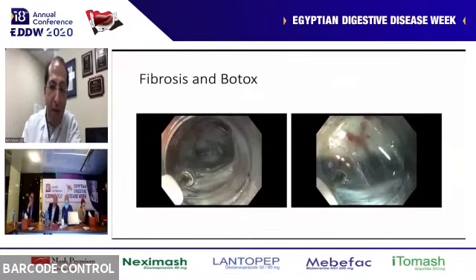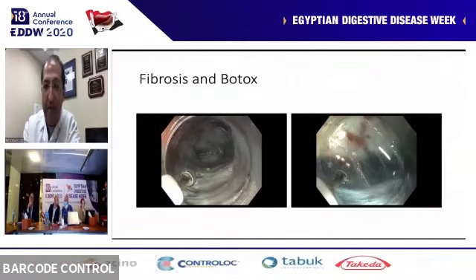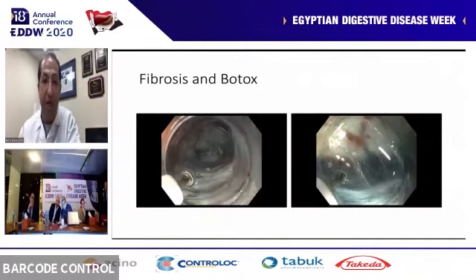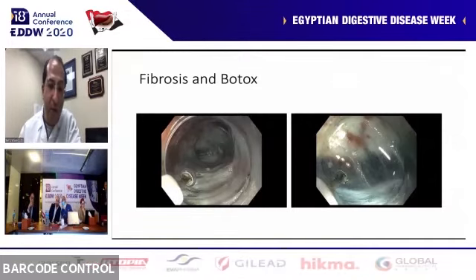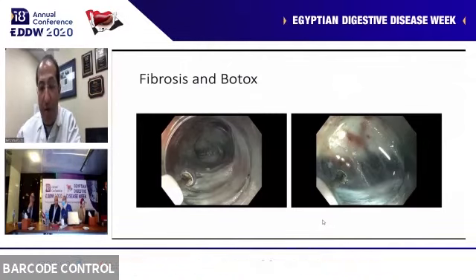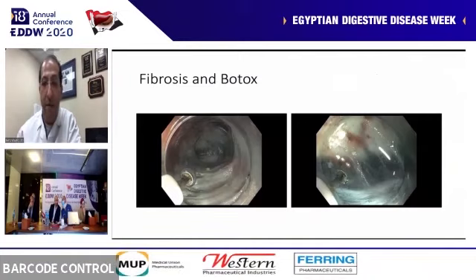Again, Botox gives a lot of fibrosis. In that case to the left, and also in a close look up to the right, you see the mucosa and the muscle are very adherent together. And my third space is very tight, a very challenging case. This lovely lady was 82 years old, had multiple Botox injections every 6 months for like 15 years. It was one of the most challenging POEMs that I've done. And again, that's from a repeated Botox injection.